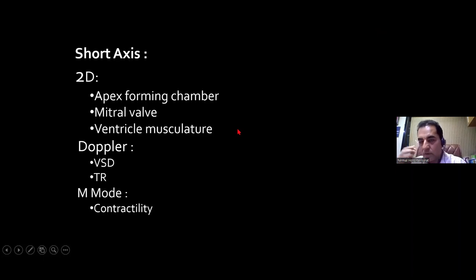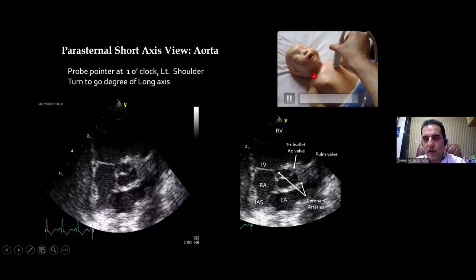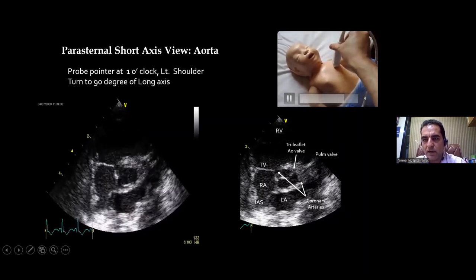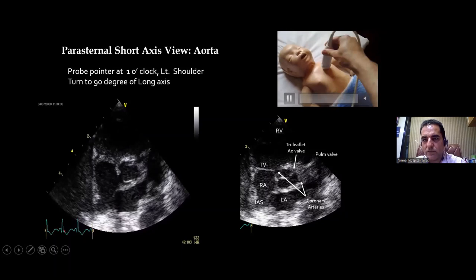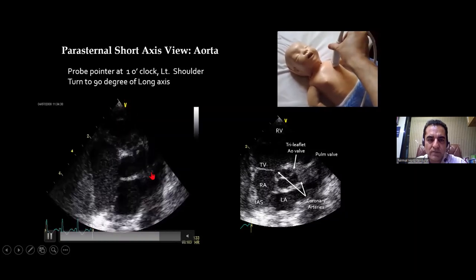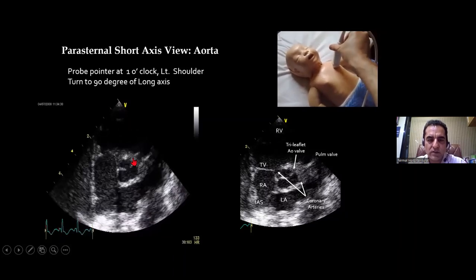It starts from the root of the aorta, that is the base of the heart from where the aorta starts. The probe marker, which was facing at the 11 o'clock position towards the right shoulder, is now rotated at the same place at the nipple line on the left of the sternum to the 1 o'clock position — right angle to the previous orientation. The heart is now being cut in short axis, in cross section.